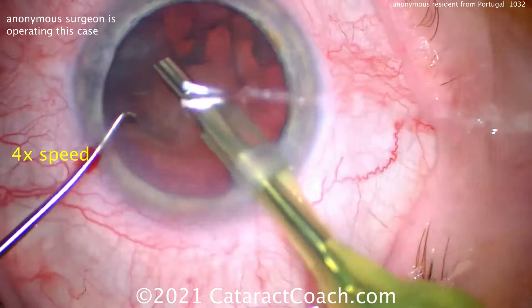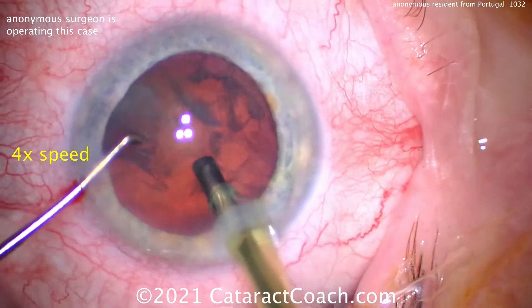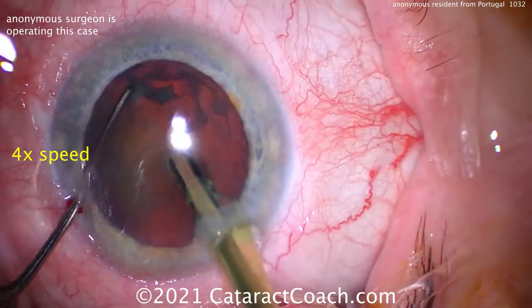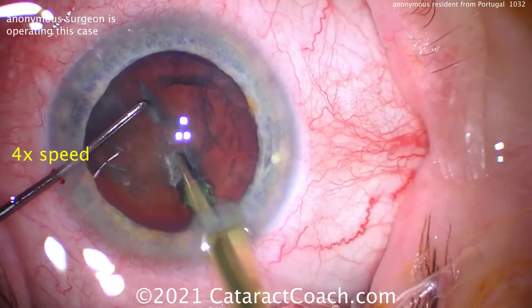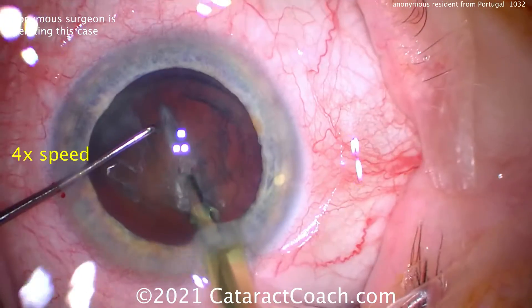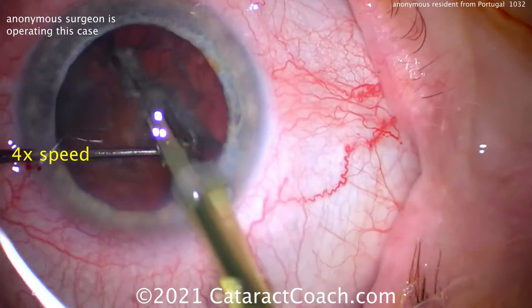Here comes the FACO probe going in the eye, taking out some of that anterior cortex. Burying the tip in here — let's see if the chop goes through. And no, because we lost holding power. So try again. Buzzing in, chopper placement — there you go, you got it done.